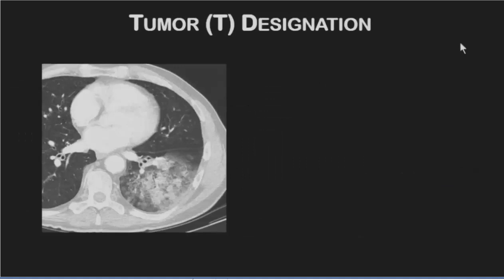So before I move on to the nodal descriptors, I want to spend just a few minutes talking about some of the limitations with regards to the current system and tumor staging. One of these involves trying to measure these lesions because, as you often see in clinical practice, there are tumors like this that just manifest as consolidation or some ground glass opacity and airspace opacity. And the question is, where would you really measure this? And you really can't, because it's hard to identify what part of this is tumor and what part could be hemorrhage or something else going on.